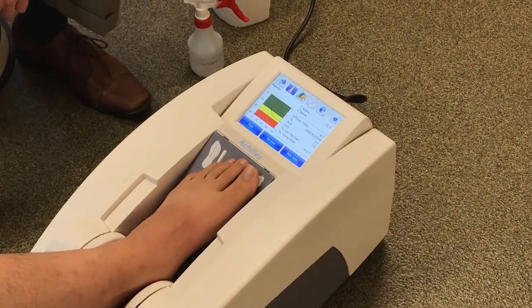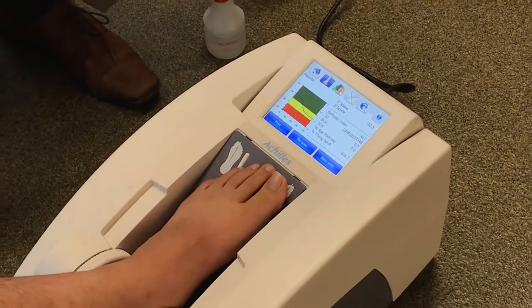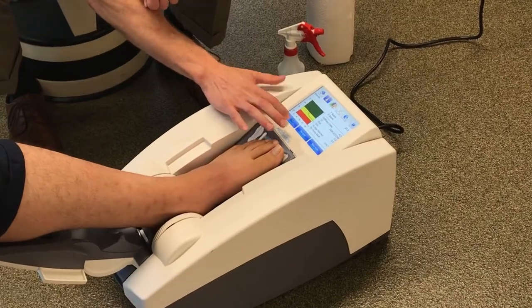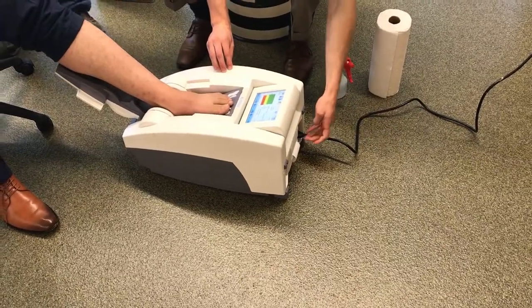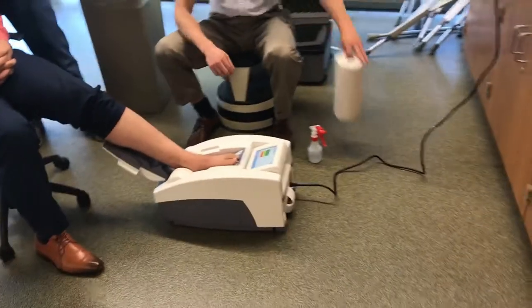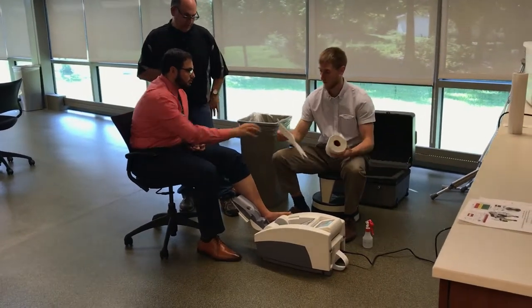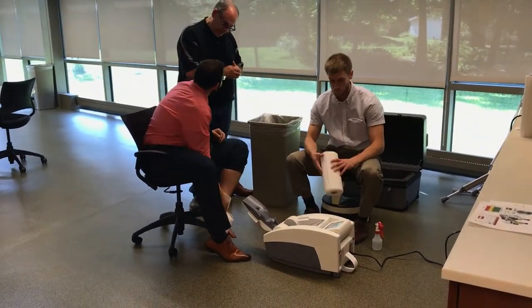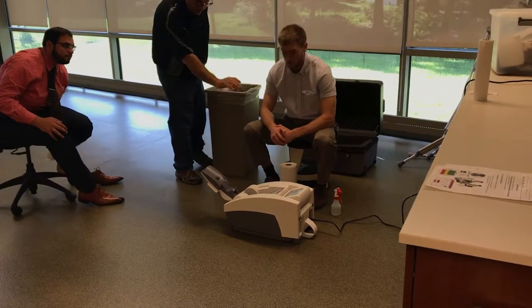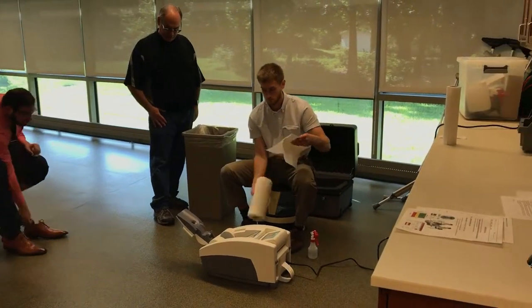We have the patient's results — we'll discuss how to read and interpret those in a different video. At this point, go ahead and hit the print button because we're going to want to print off a copy of their results. Have the patient remove their foot from the machine. Give the patient some paper towel so they can dry off their ankle and foot and put their shoes and socks back on. The test is over. This is a good time to do a quick pat-down of the foot rest and calf rest between patients while they're doing that.